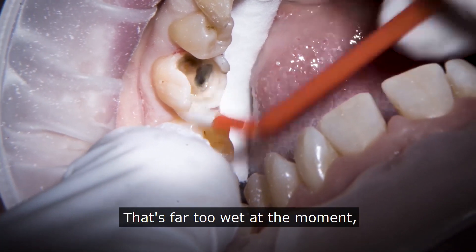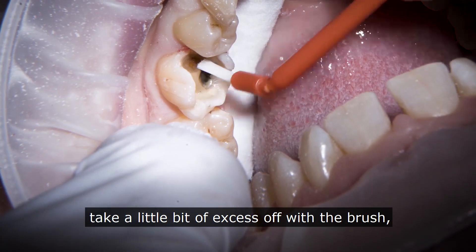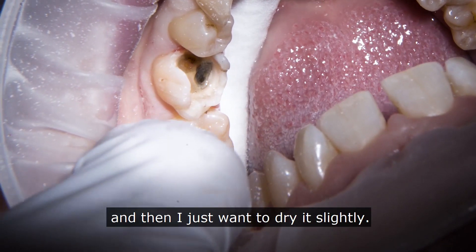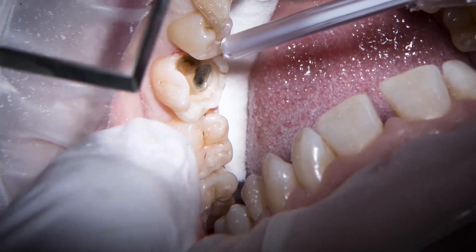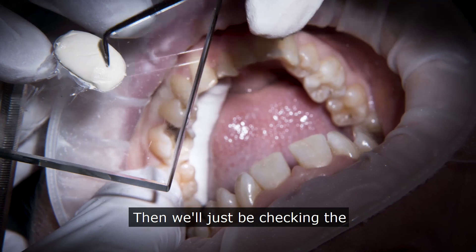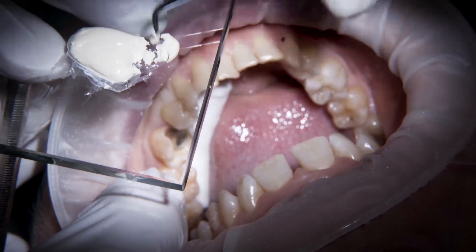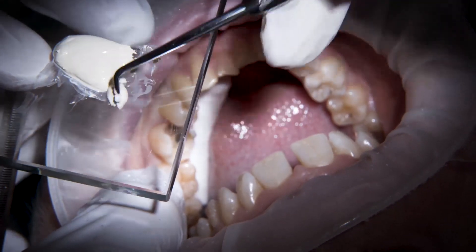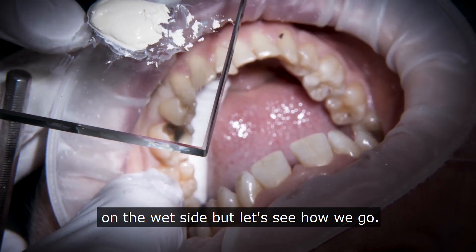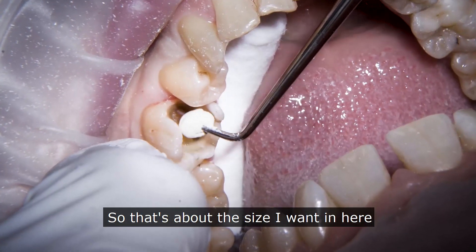That's far too wet at the moment — it's just getting that just right. I take a little bit of excess off with the brush and then just dry it slightly. Then I'll just be checking the consistency of my biodentine. I'm quite happy with that — just a tiny, tiny little bit on the wet side. Let's see how we go.